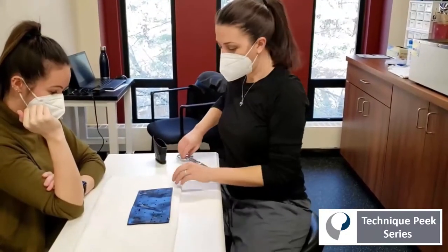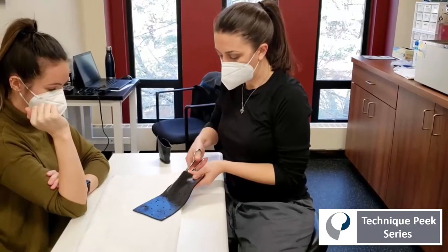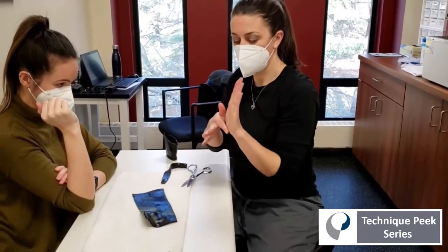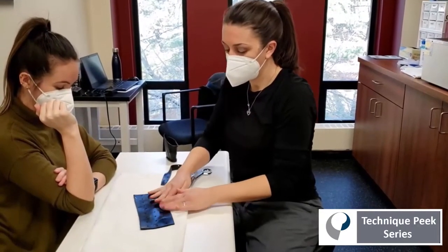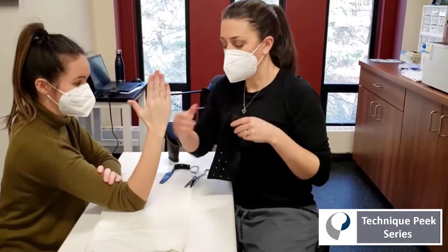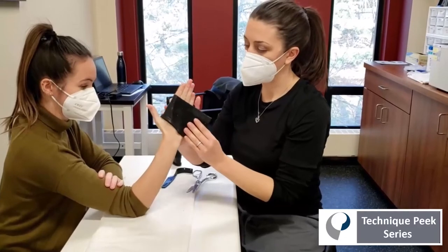We've warmed up our piece of scrap material and cut it into an even rectangle, keeping in mind that you're going to try to clear the IP joints of the fingers. I like to roll off a semi-circle to make space for the thumb, then have the patient positioned with their fingers in maximal extension, put that curved piece right in the thumb web space, and just wrap around.